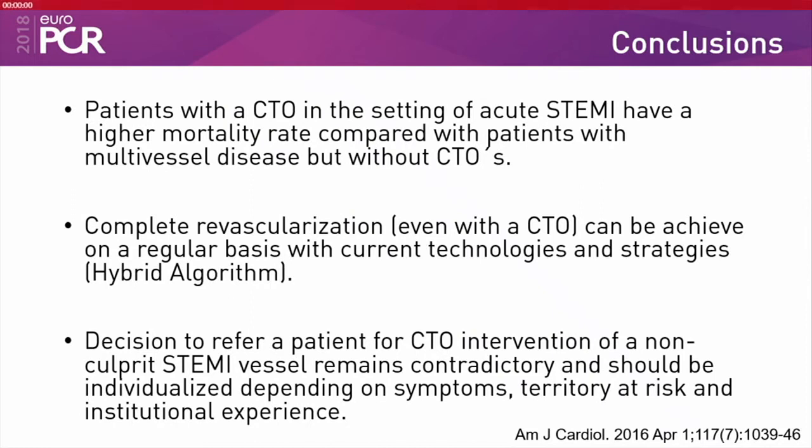the only way. If you demonstrate a lot of ischemia, it's not only the patients that must have the CTO opened, because if you're not analyzing the donor vessel's territory, that patient could benefit if you open the CTO in the other area. Ischemia with the stress echo, not with the FFR. FFR in the CTO is not that good an option.